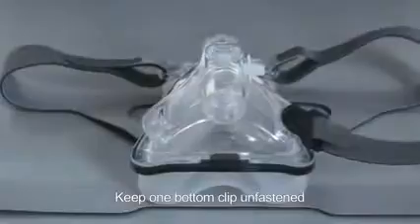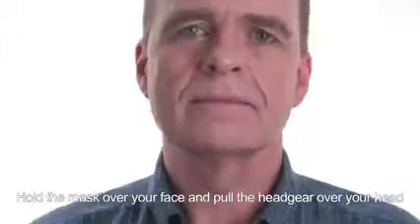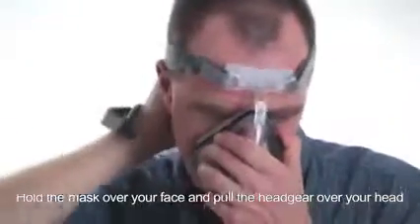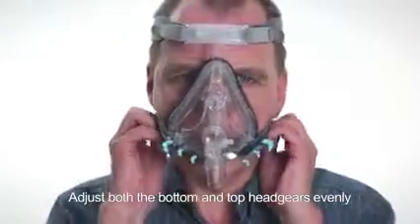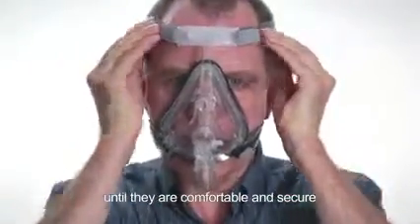Keep one bottom clip unfastened. Hold the mask over your face and pull the headgear over your head, then connect the unfastened clip to the mask. Adjust both the bottom and top headgears evenly until they are comfortable and secure.